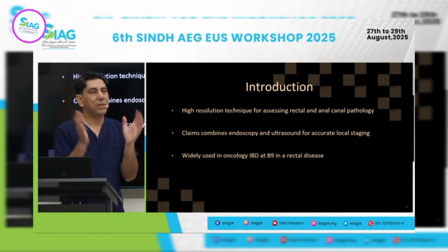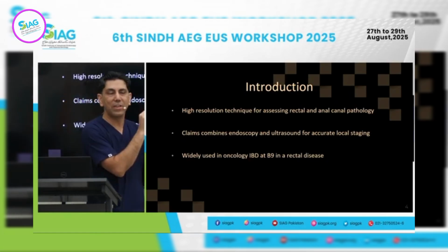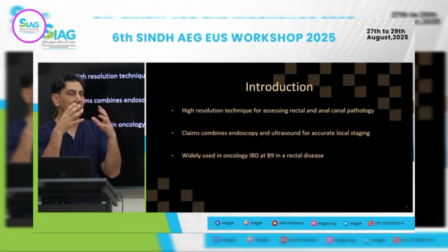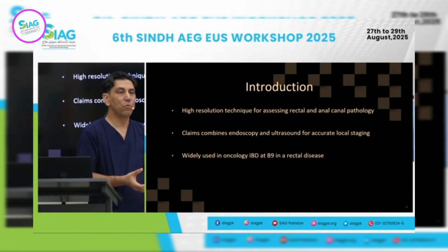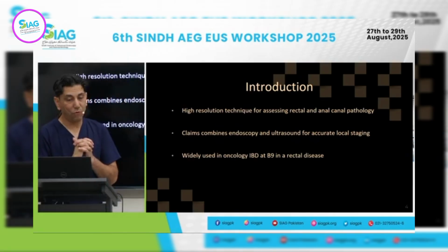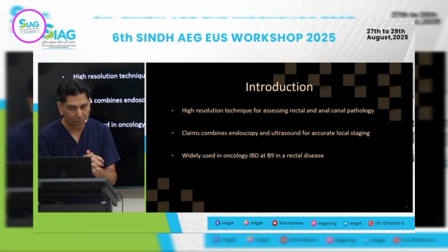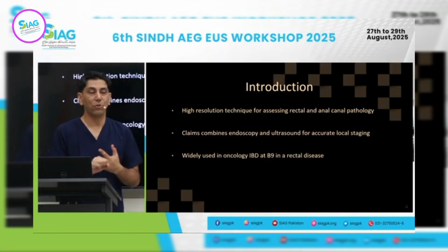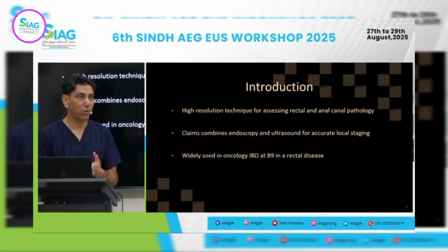So if a person does not have major pancreaticobiliary interest, or they're not a hepatologist or a gastroenterologist with upper GI pathologies, and they have most interest in IBD, this is certainly a tool which is also helpful to them. So you can be very useful to your oncological colleagues and also your colleagues who have interest in inflammatory bowel disease.